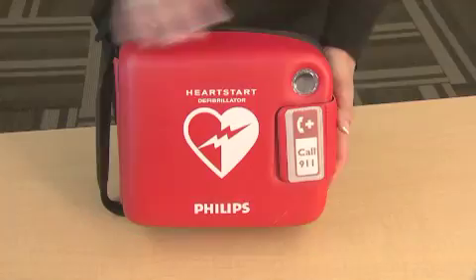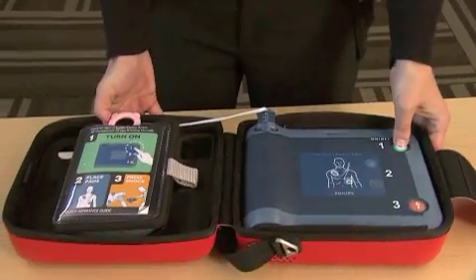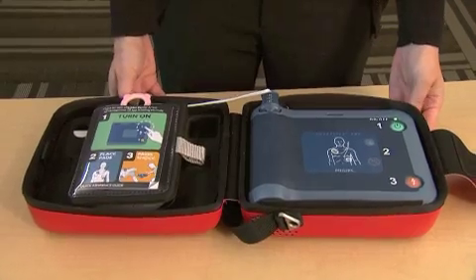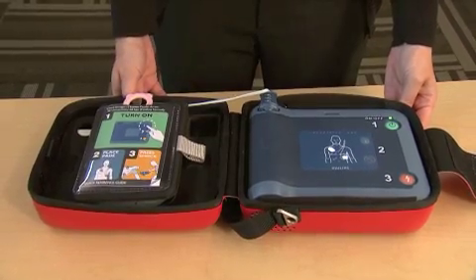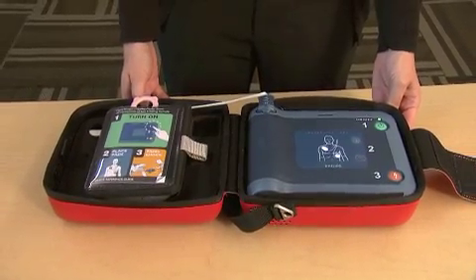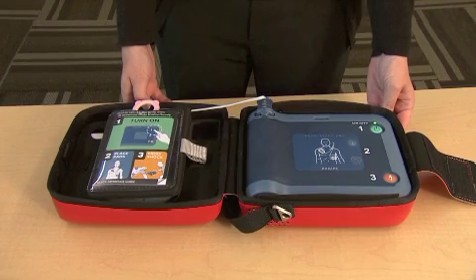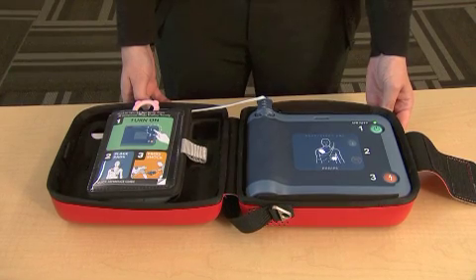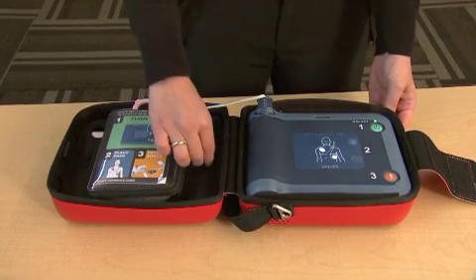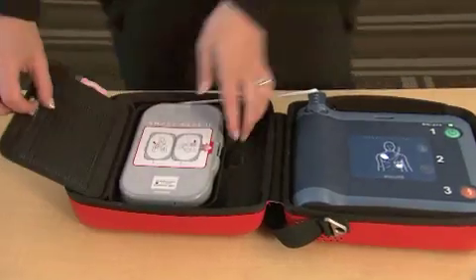Open the AED case and turn on the device. The unit has pictures and voice commands that walk you through the steps. Remove clothes from patient's chest. When patient's chest is bare, open the gray plastic case and peel off white adhesive pads.